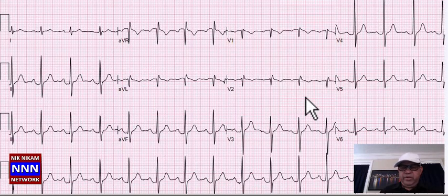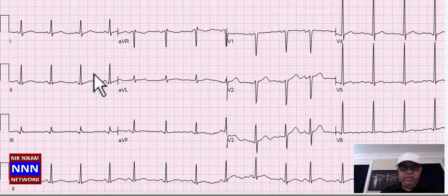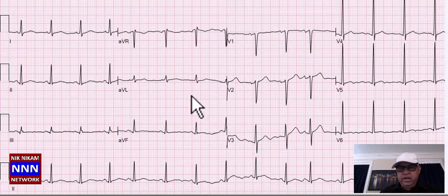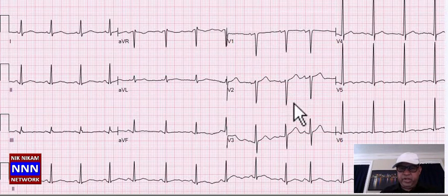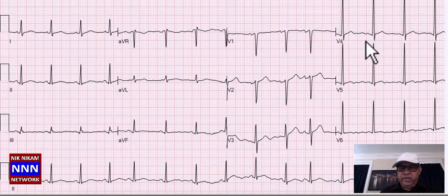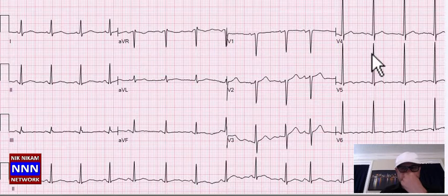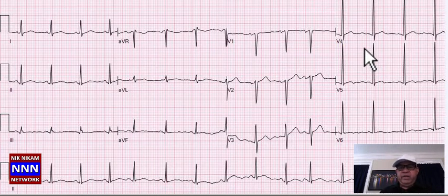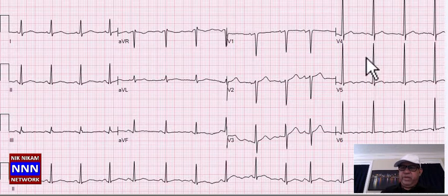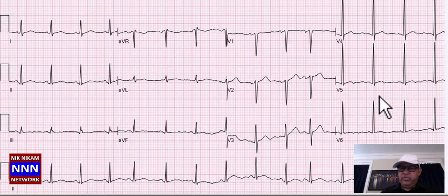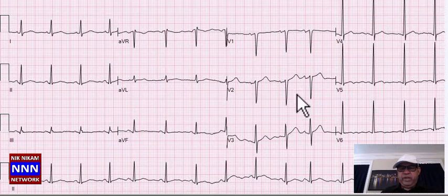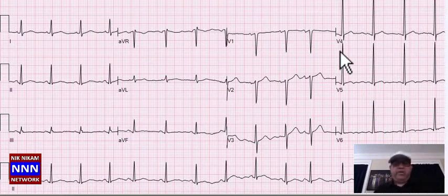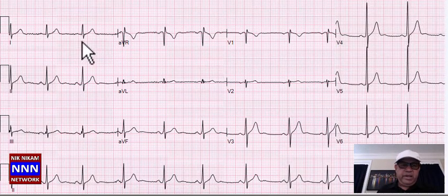Here we have sinus rhythm. Inferior wall: T-waves are flat. In the anterior leads: loss of R-waves, possibly related to lead positioning. ST-T changes throughout. The voltage here — if the negative and positive voltages combined are 33-35 millimeters, you worry about possible left ventricular hypertrophy. Along with ST-T changes, this adds to LVH. So this is sinus rhythm with non-specific ST-T changes and possible left ventricular hypertrophy.